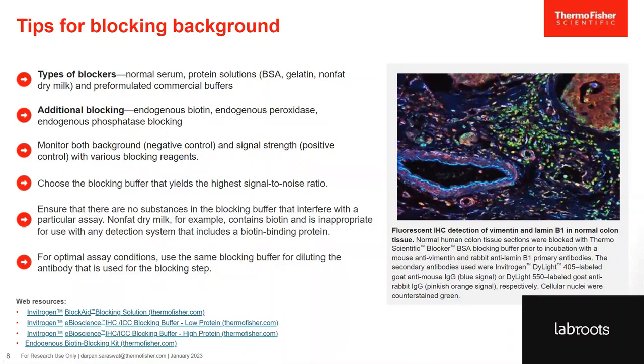Suppose you are using biotin binding protein and you want to use dry milk for that. Dry milk contains biotin, so in that case dry milk is not the right blocking buffer for your experiment. For optimal assay, I would highly recommend that you use the same blocking buffer for diluting your primary antibodies.